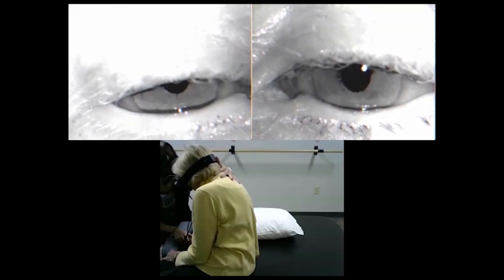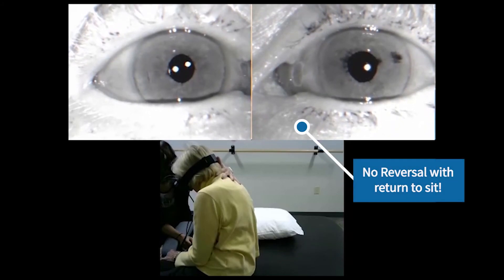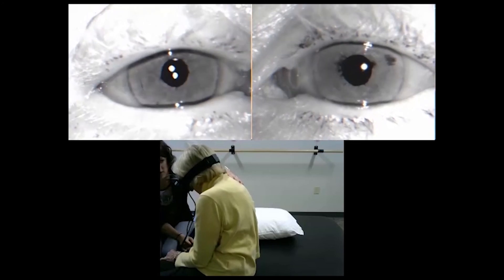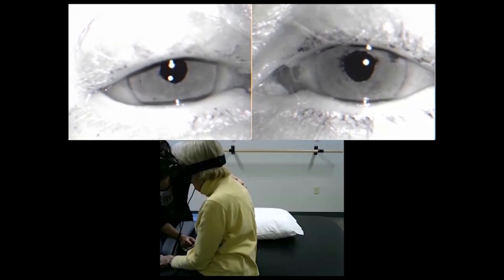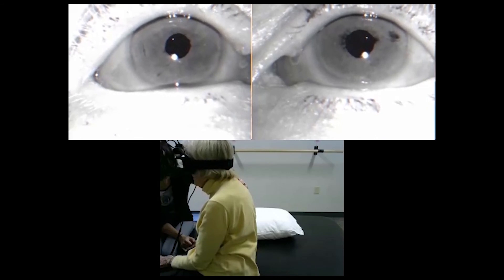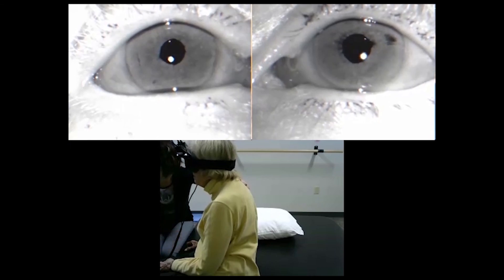I'm going to wait here a couple seconds — you let me know if you get dizzy. I'm here with you. Eyes open nice and wide. Slowly pick your head up so you're looking straight ahead at that poster again. Good job.